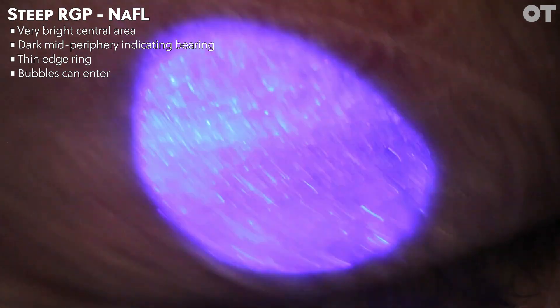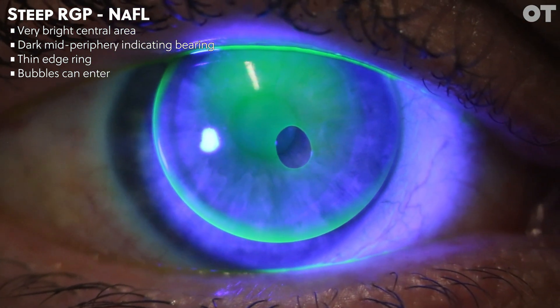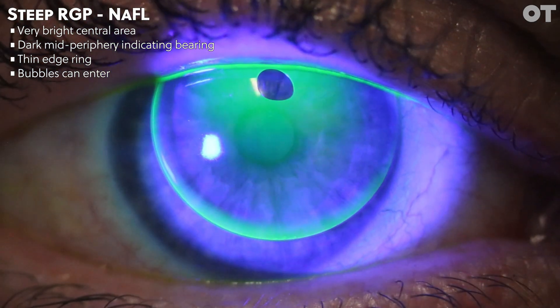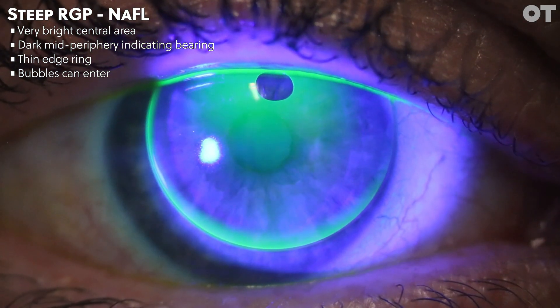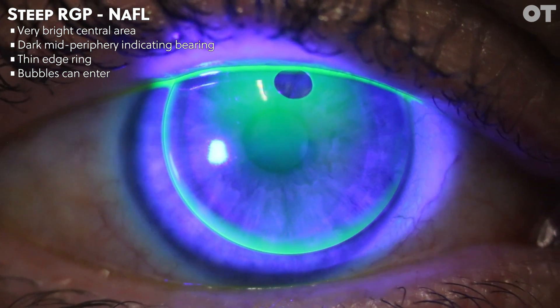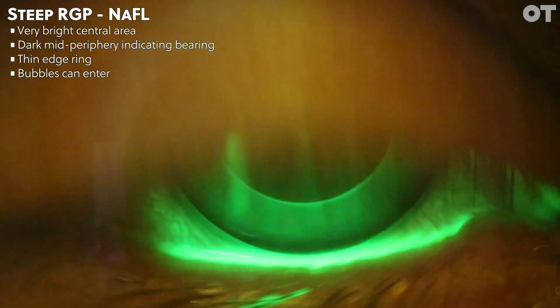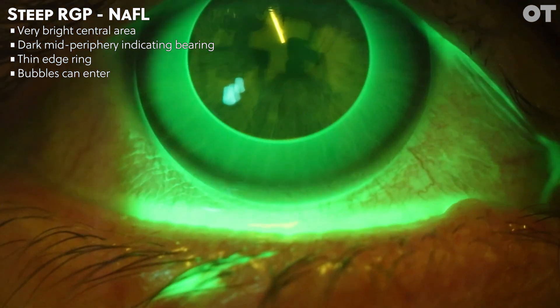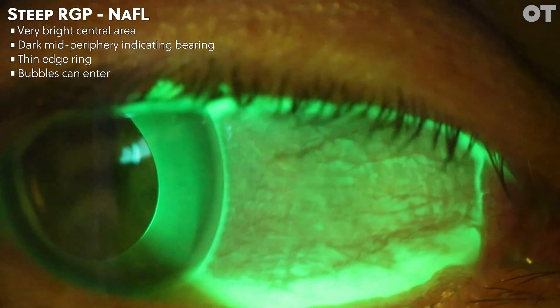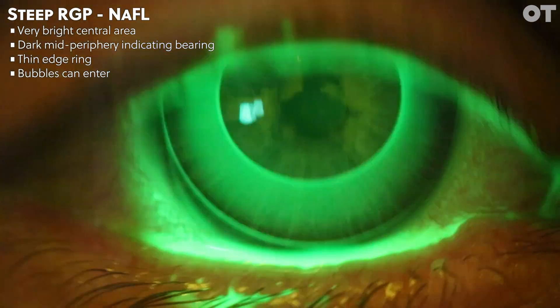The second video exhibits a very similar fitting pattern to the first, and it shows that with a very steeply fitted contact lens, bubbles can be introduced underneath the lens. These bubbles are introduced to the thick post-lens tear layer on insertion of a steep lens. Here we can see a large bubble centrally under the contact lens. If you're not careful, you could misinterpret the dark area where the bubble is as central touch, leading you to think that this is a flat fit — it is in fact a very steep fit.